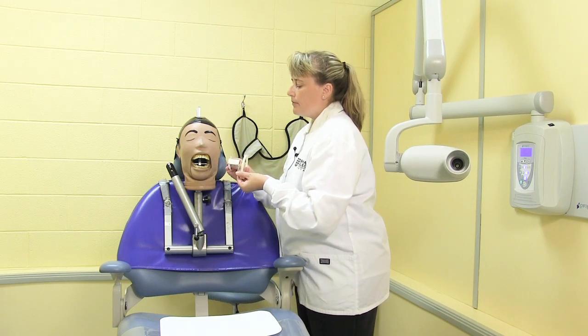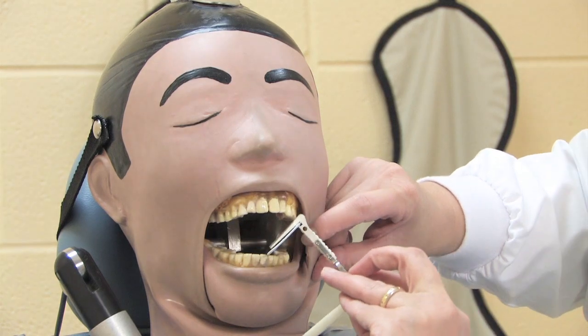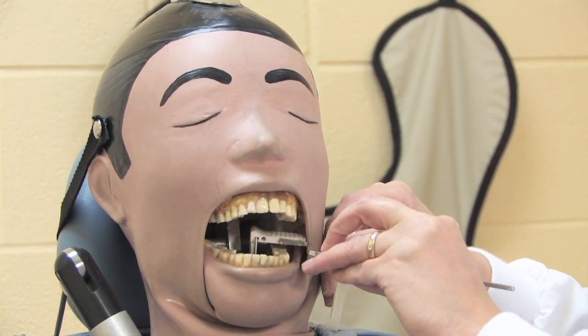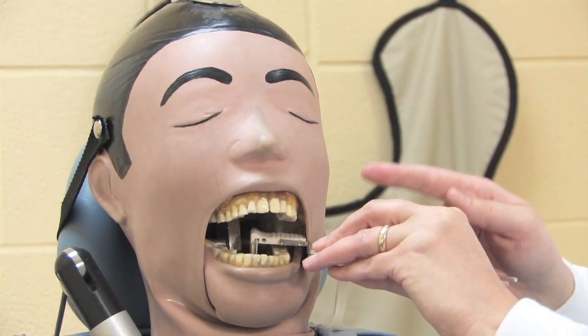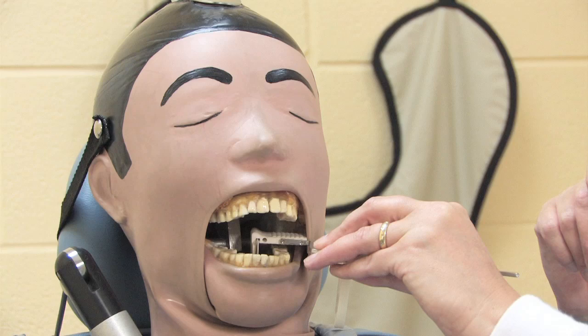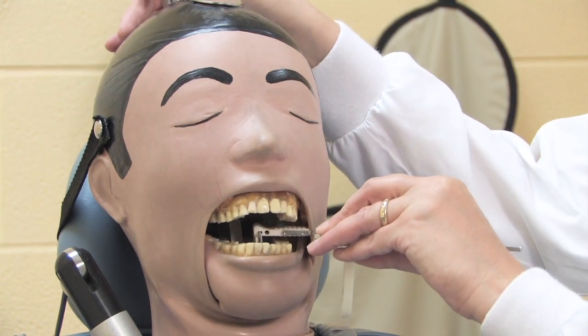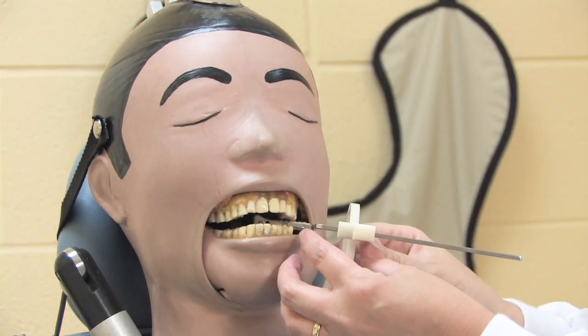For the molar shot, I'm going to place the film away from the teeth. I want to image the distal half of the premolar. The film needs to be, again, parallel to the long axis of the teeth that I'm imaging.